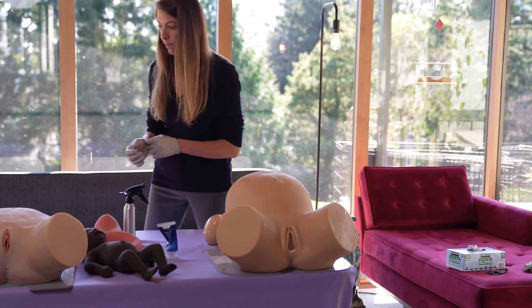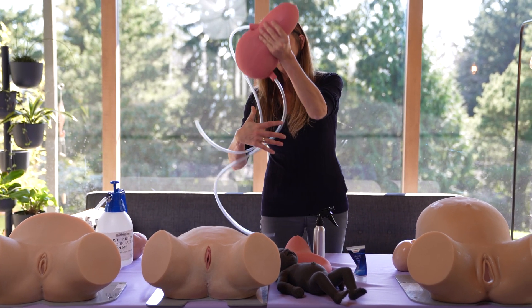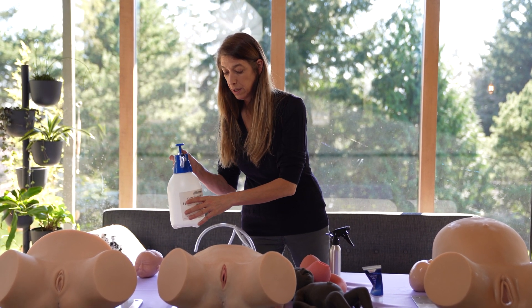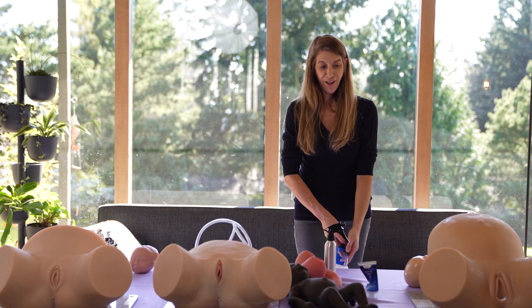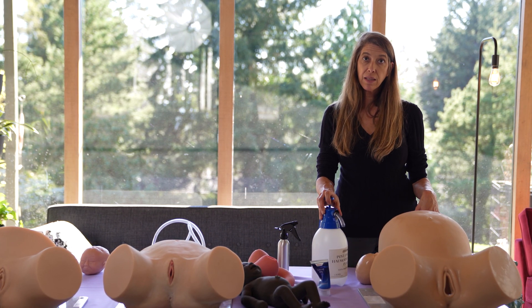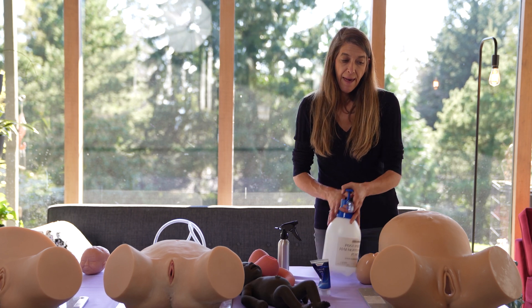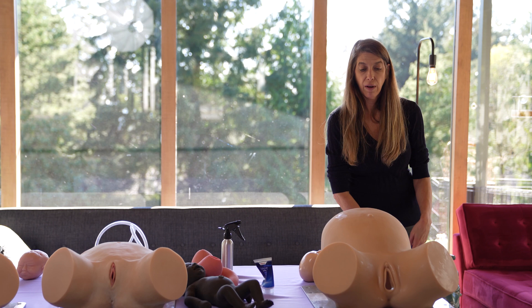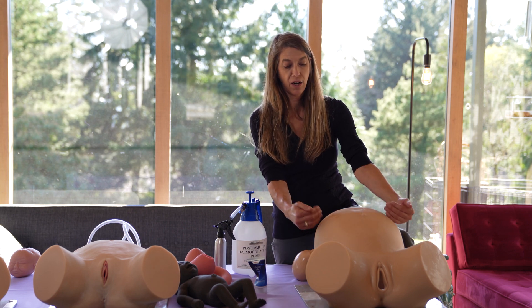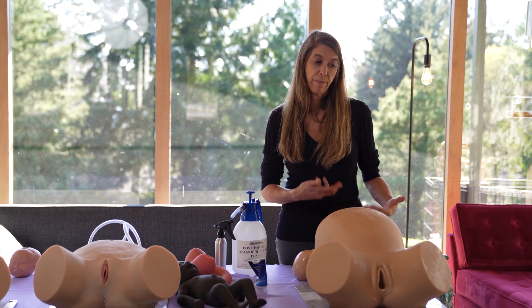We also have an option of a postpartum hemorrhage simulation through the model. There is a uterus with tubing that attaches to a device which is full of synthetic blood. If you have a longer cord you can kind of hide it behind something. A lot of our customers do this with a simulated patient behind — the patient gives the landmarks and signals to the learner as to what is transpiring, while the simulated partner is in control of blood flow. You can get up right behind this model and either put legs through and use those, or just have no legs in the scenario, with the patient behind a drape running the rest of the simulation.